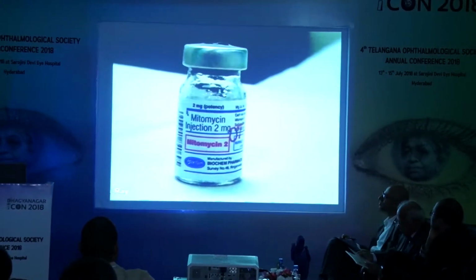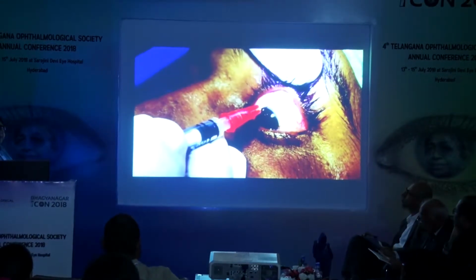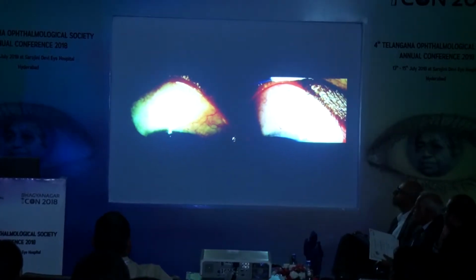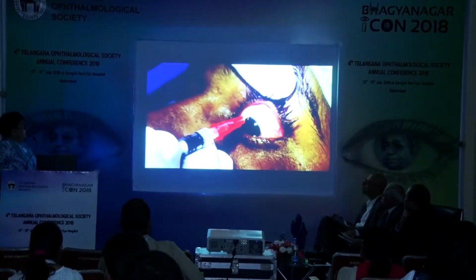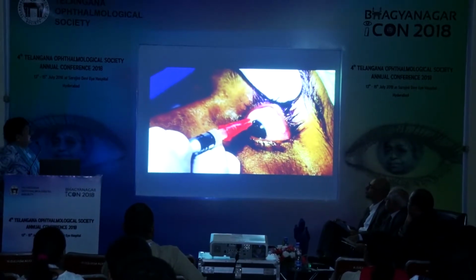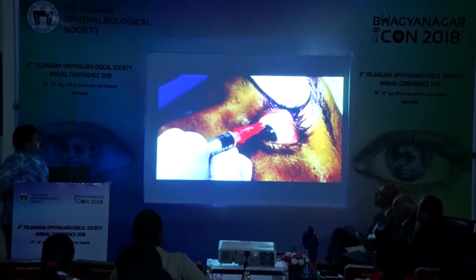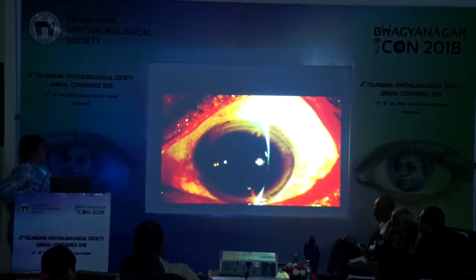We surmise that inadvertent concentrated dose of mitomycin C could have been injected, as the authors have now performed over 200 such standard procedures, injecting a fixed dose of 20 micrograms prior to filtering surgery, with or without phaco, with no unwanted sequelae.